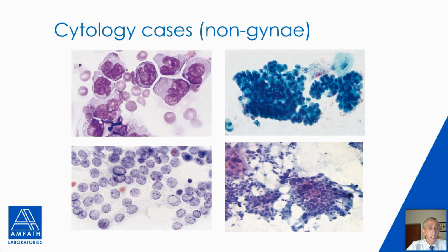In this particular aspirate, one can actually see small nucleoli, but also in that image, towards the bottom right, one notices a nuclear pseudo-inclusion, as well as in another cell, a nuclear groove. And these are telltale signs for papillary thyroid carcinoma. Then the last image on the bottom right is an aspirate from a breast mass. This is ductal carcinoma, and it is characterized by a hypercellular aspirate of discohesive tumor cells showing nuclear atypia.